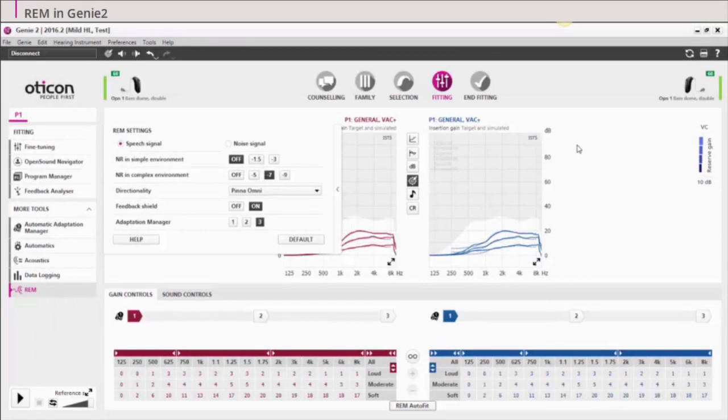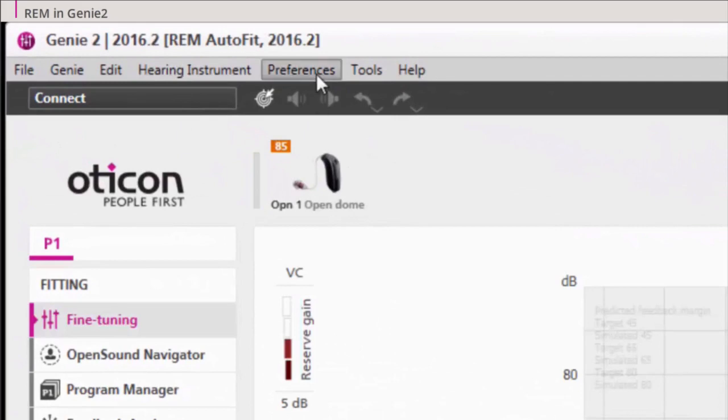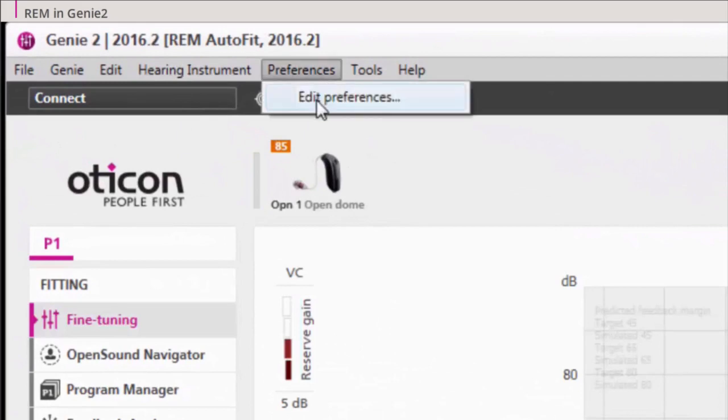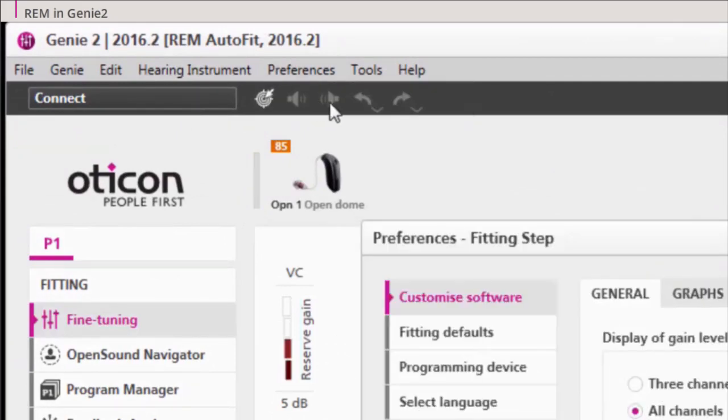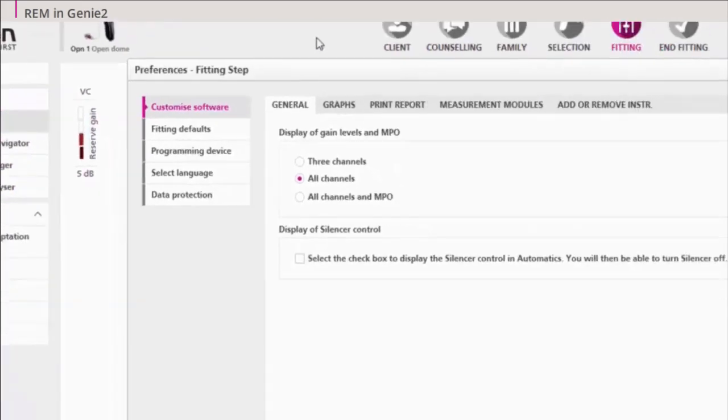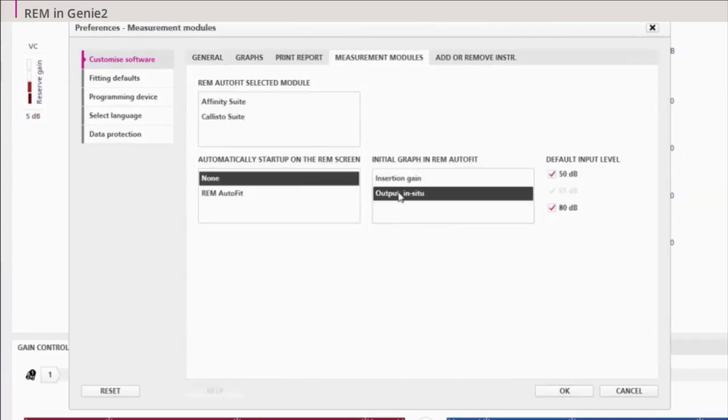You can choose to see the measurement either as insertion gain or output in situ. Go to the Customize Software screen. Choose Measurement Modules. Under Initial Graph in AutoFit, select your preference.